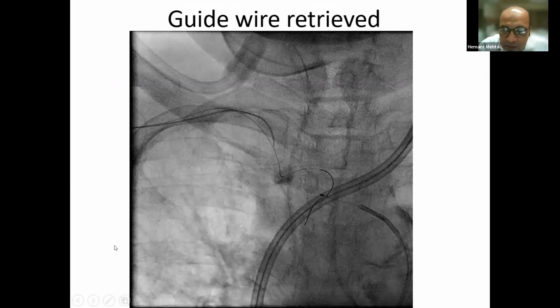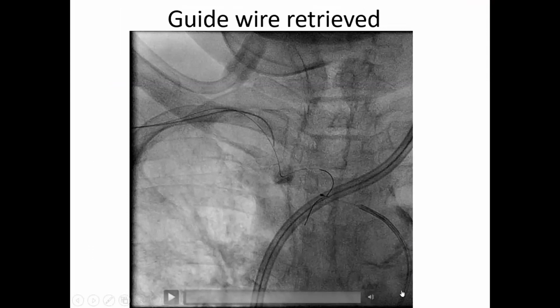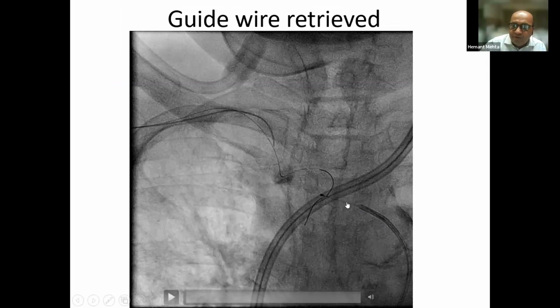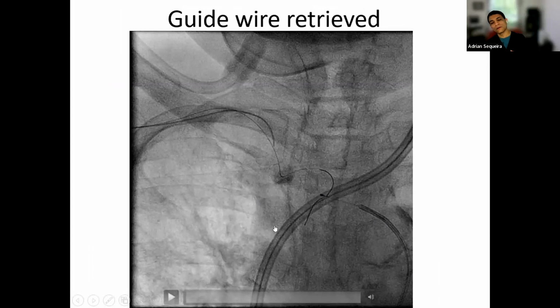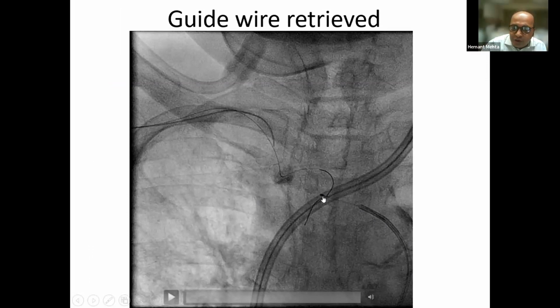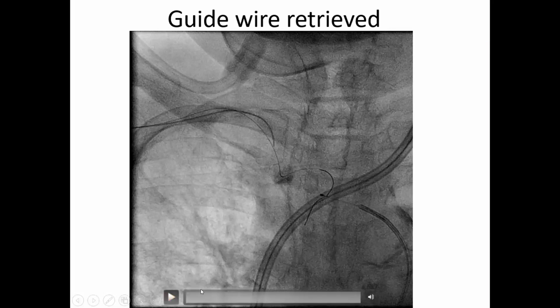So you see, this is your catheter that's in the aorta, and this is the coronary wire, 0.014, which we had angulated here. So with the balloon pushing the wire, the broken wire, this was looped here. And as we did that, you see slowly.